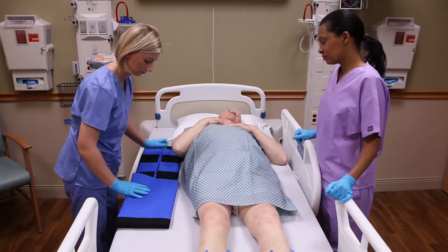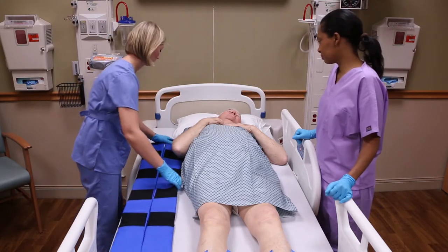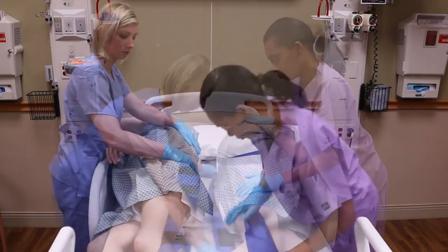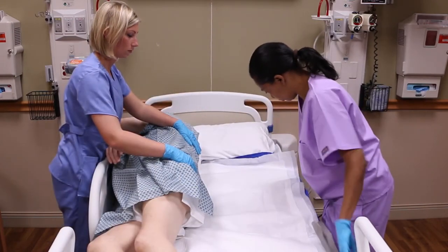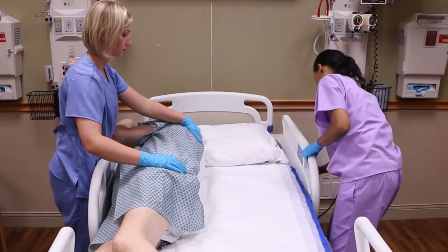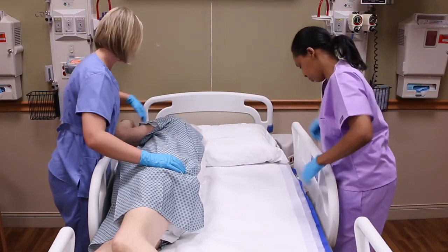Unfold the glide sheet and align the upper edge with the patient's shoulder. Using your facility's protocol for placing items beneath the patient, place the glide sheet beneath the patient. Make sure the patient is centered on the glide sheet. Smooth out any wrinkles in the glide sheet and raise the bed rails.